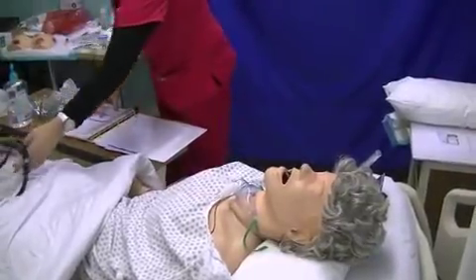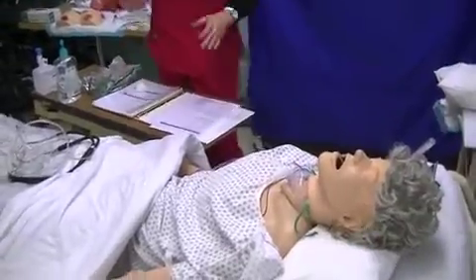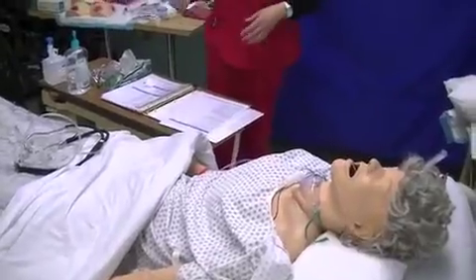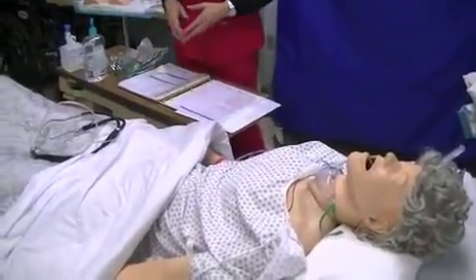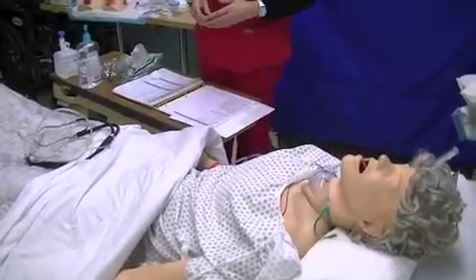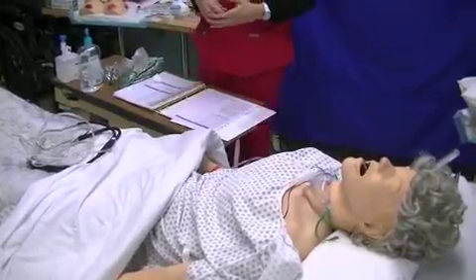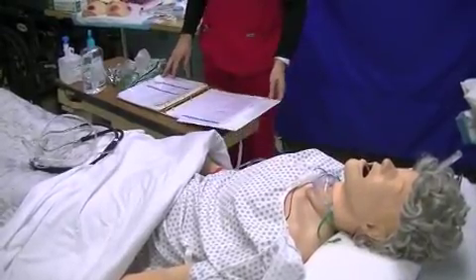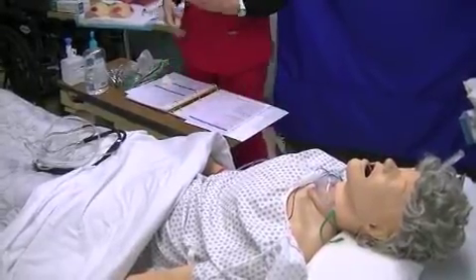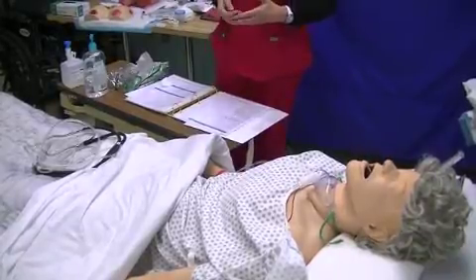Now, there are certain oxygen therapy precautions that you need to know. Usually we post a sign that says oxygen in use, because oxygen can be flammable, it can feed a fire. So we want to make sure there's no smoking permitted near the oxygen delivery device. We want to use a 3-prong plug for electrical devices to prevent sparking, and no open flames or candles near the oxygen. No electrical equipment with frayed cords or loose wires, because again it can be combustible. And especially no petroleum products like Vaseline around oxygen.